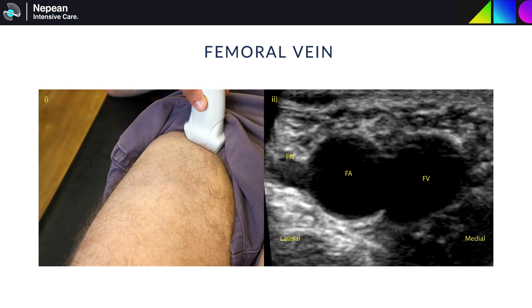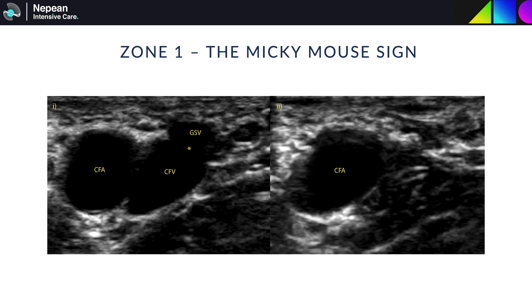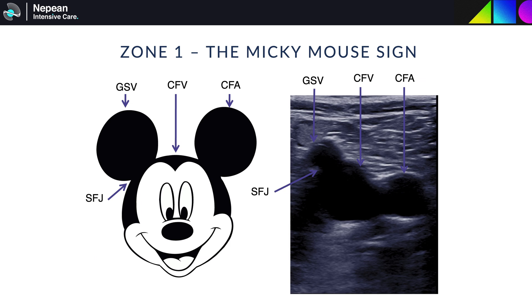The femoral vein is seen adjacent to the femoral artery at the level of the inguinal ligament — a view that many of you are familiar with from central line insertion. As this is followed inferiorly, the junction between the common femoral vein and saphenous vein can be seen. This is known as the saphenofemoral junction and is point one of the three-point scan. The anatomy at this point is commonly referred to as a Mickey Mouse sign, with Mickey's face representing the common femoral vein and the ears the common femoral artery and the saphenous vein.